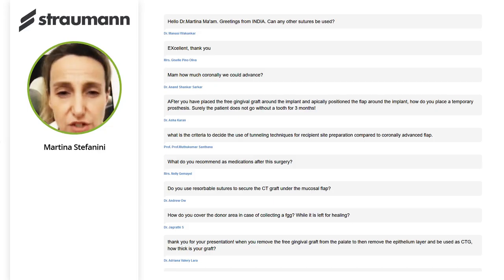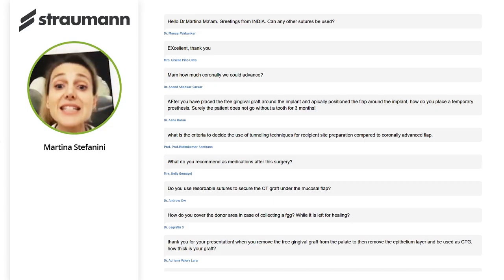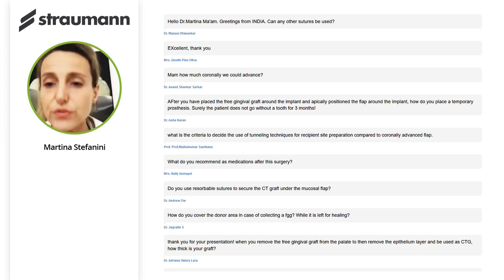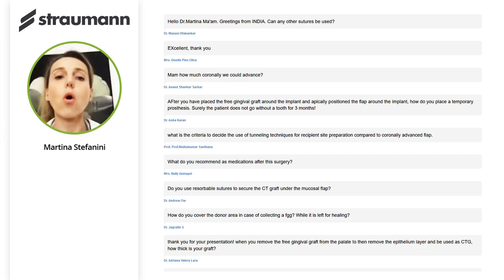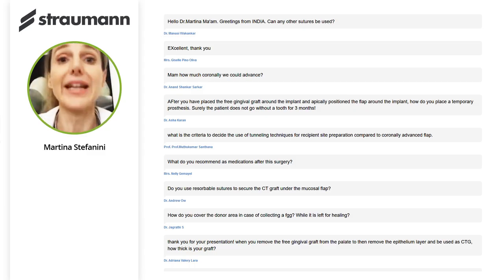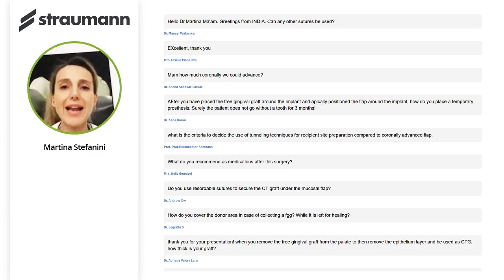Are the vertical incisions split thickness or full thickness? Does one reduce the risk of scarring? The vertical releasing incisions are always performed split thickness with the blade beveled. You never touch the periosteum perpendicular to the bone like this.